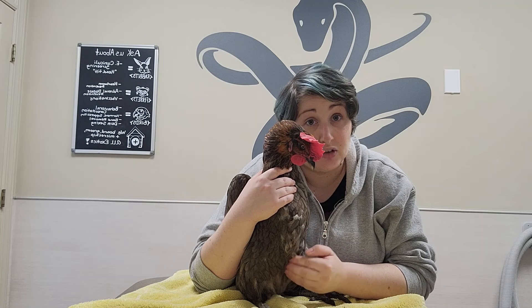The area that we like to do intramuscular injections in chickens is the pectoral muscles, or the breast area. You will feel your chicken and you can feel a pretty prominent keel bone running down the center of their chest.